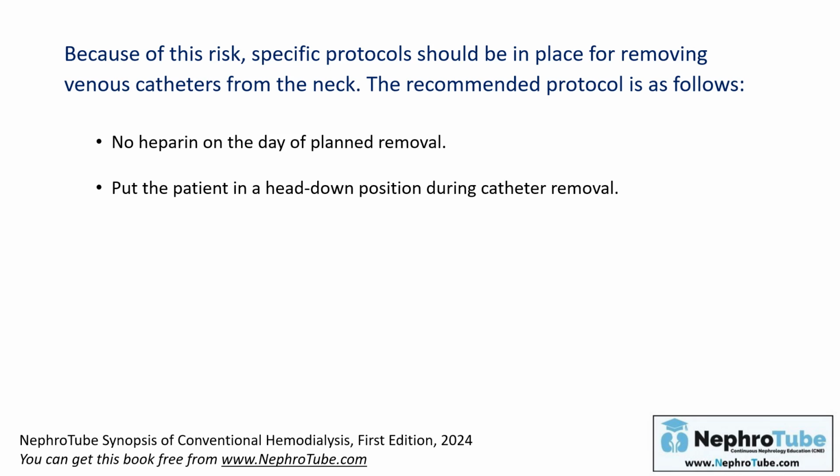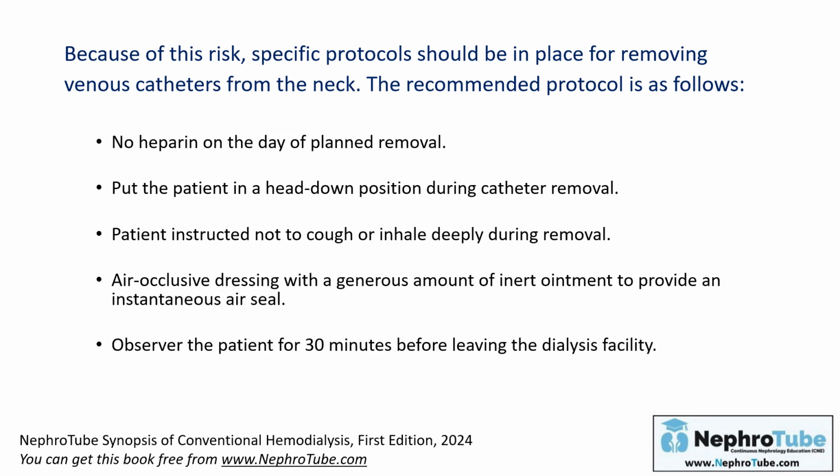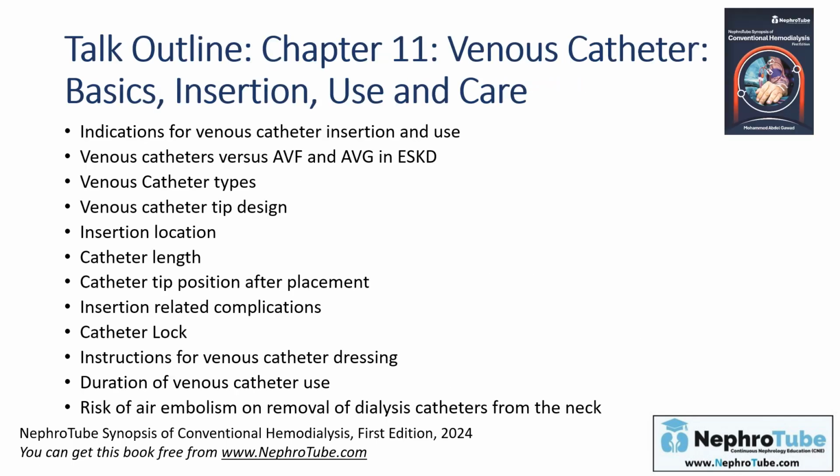You have to put the patient in a head down position during catheter removal and instruct the patient not to cough or inhale deeply during the removal. You have to use an air occlusive dressing with a generous amount of inert ointment. And finally, you have to observe the patient for 30 minutes before leaving and leave the air occlusive dressing in place for at least 24 hours.